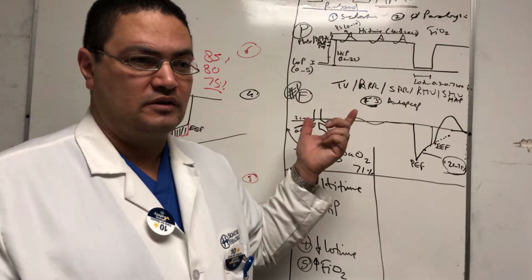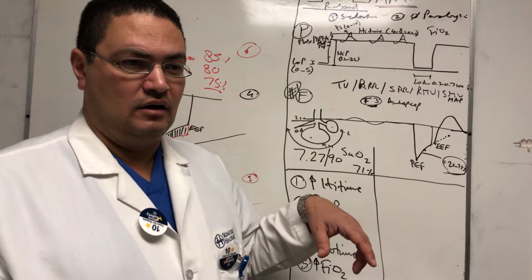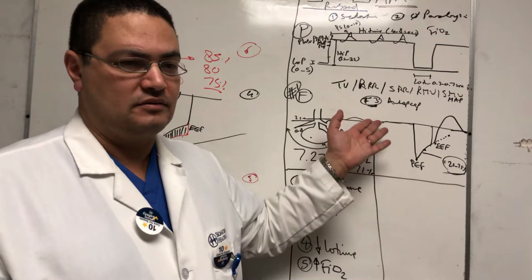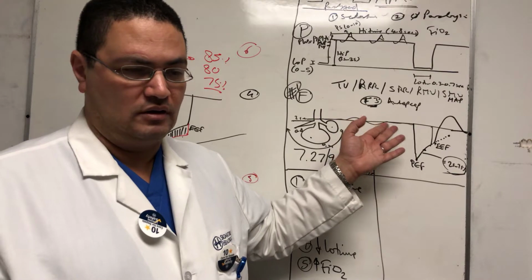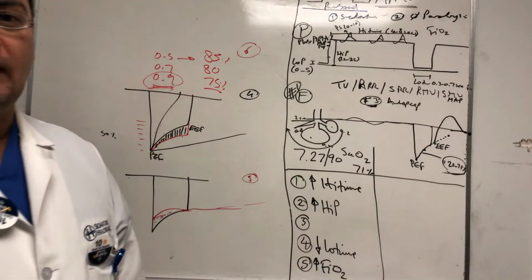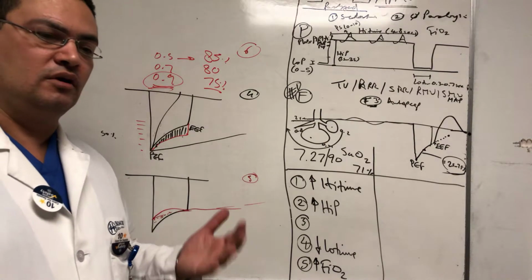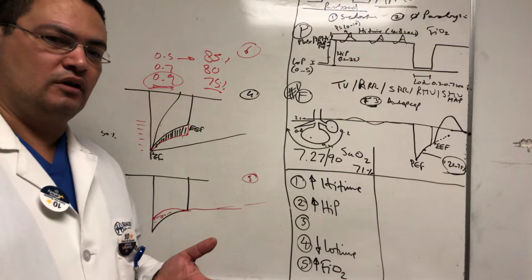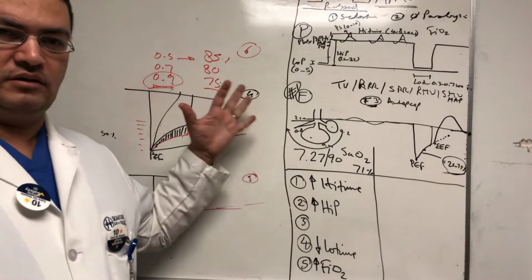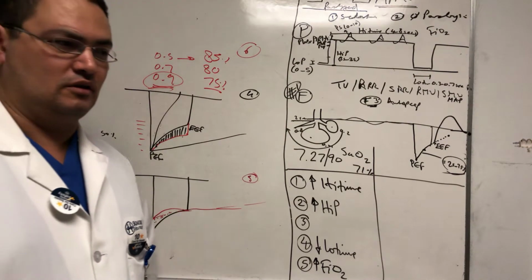So I wanted to give 6 seconds high time and 0.5 low time. No, I give 5.5 seconds for the high time and 0.5 for low time if I'm dealing with a stupid vent. And the problem with these stupid vents is that they were designed, and it's old, to do more biLevel than APRV. For biLevel, the times are huge, so you can take a half a second from each, it's not a big deal.